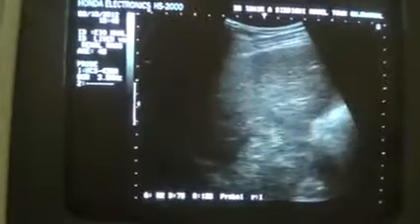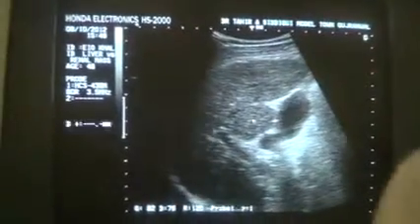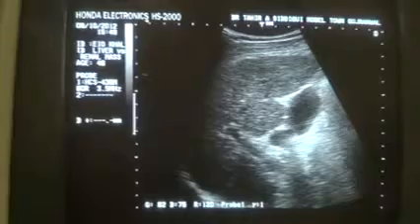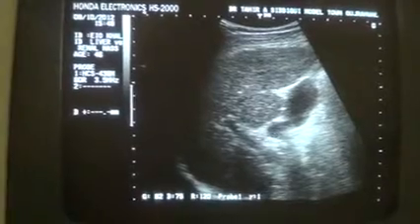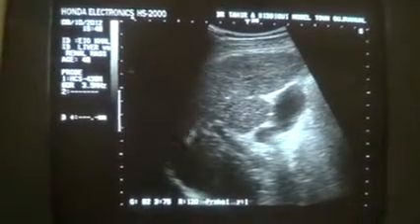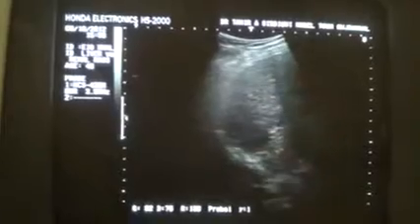Here we see the right lobe of the liver, and you can very well differentiate the degree of coarseness seen in this liver. This is the gallbladder with shaggy walls, this is the lumen — clear lumen — and this is the portal vein at right angles to the neck of the gallbladder. This is the coarseness we are seeing in the liver. This is the right lobe of the liver with irregular outer surface.